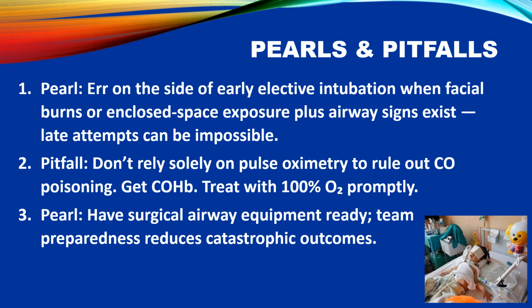3. Pearl. Surgical airway preparedness. Equipment readiness. Have surgical airway equipment ready in case of failed intubation. Team preparedness. Team preparedness reduces catastrophic outcomes and ensures optimal patient care. Importance. Being prepared for surgical airway management can save lives in emergency situations. By understanding these pearls and pitfalls, healthcare providers can improve their management of burn patients and reduce the risk of complications.